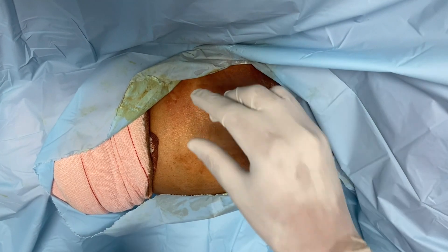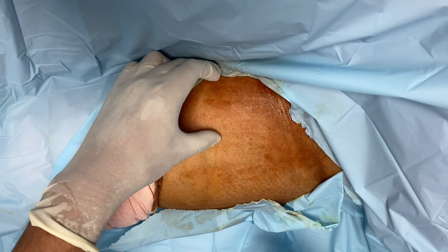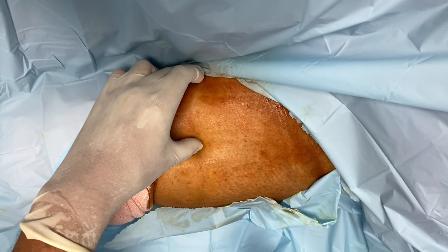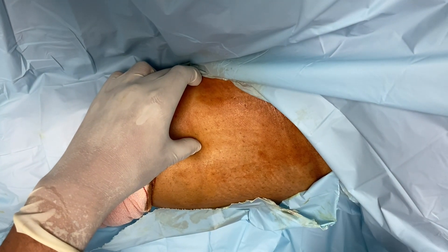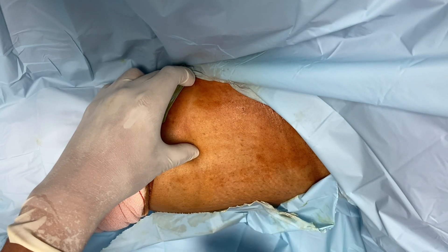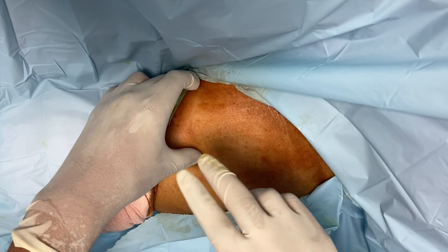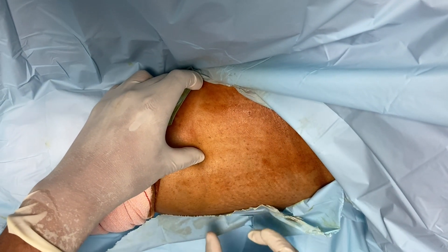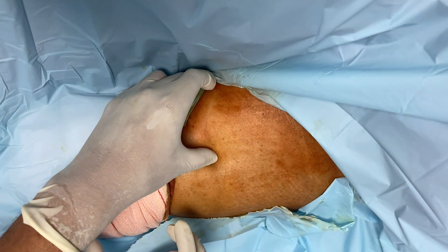The medial border is formed by the adductor magnus and longus muscles, on the medial aspect of the thigh, and we will place the probe here. For the adductor canal block, the patient should be in the supine position, the leg should be externally rotated, and we basically need to expose the medial aspect of the mid-thigh. This is the upper one-third, this is the middle, and this is the lower one.